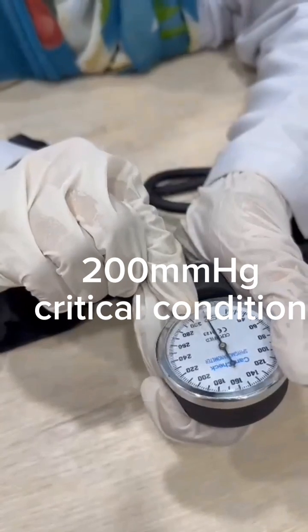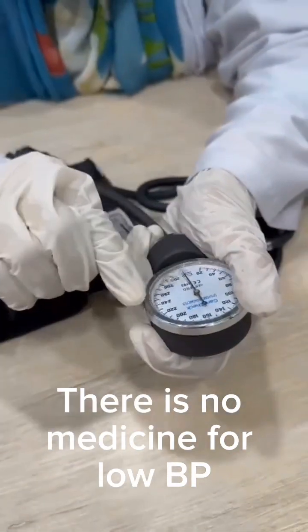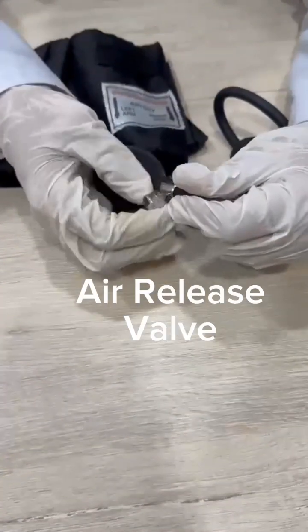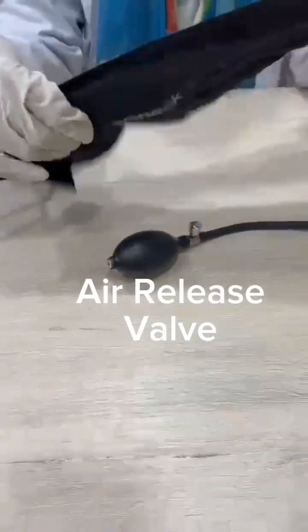200 mercury is high BP in critical conditions, and in an emergency, hypertensive medicines are given. There is no medicine for low BP. Inflation bulb and air release valve.